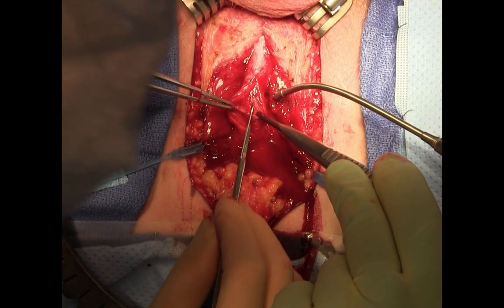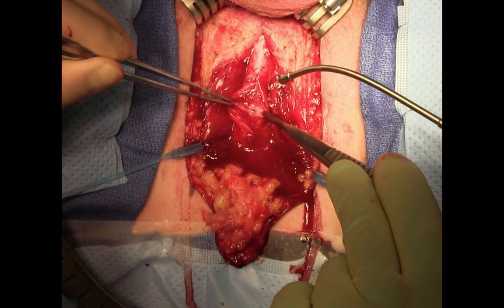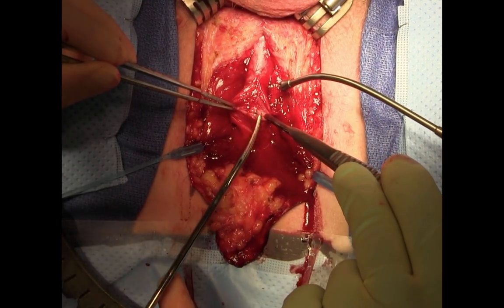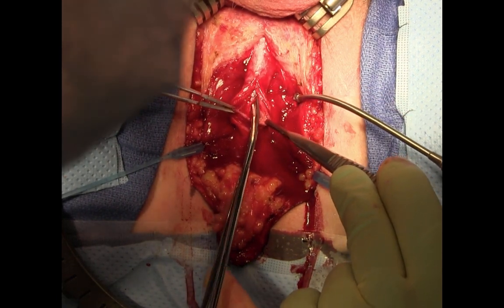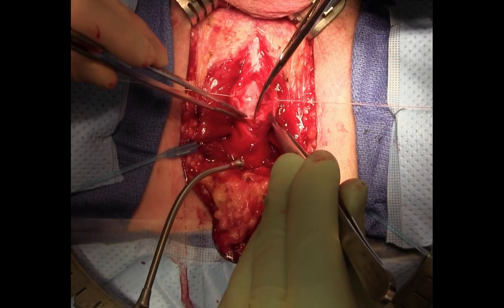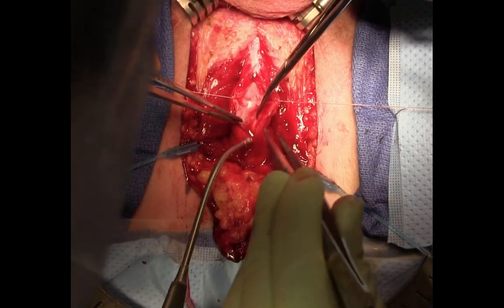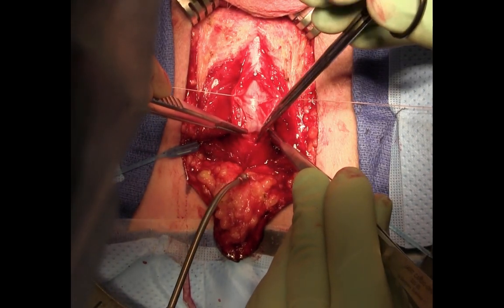Here you can see the white inside of the urethra, and a slight urethral opening is made with a knife. Once the lumen has been identified, then a scissor can be used to open the urethra widely. The urethra is now opened along its ventrum, proximally down to the level of the external sphincter.